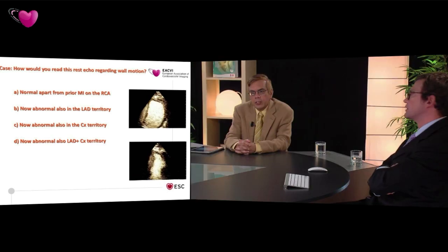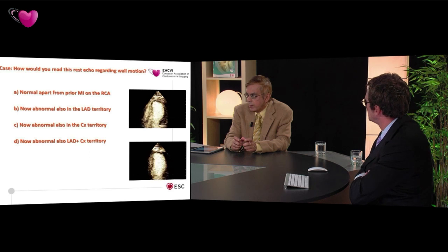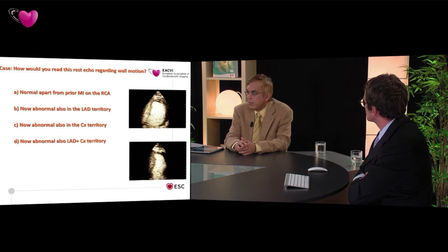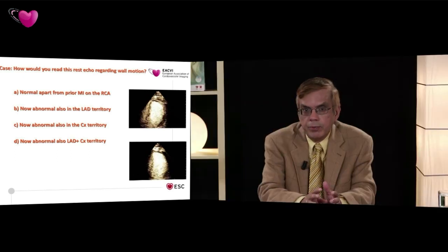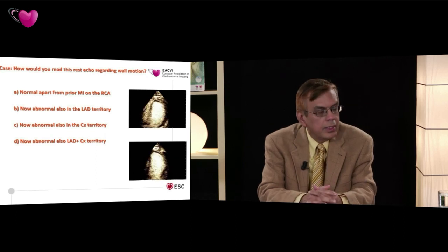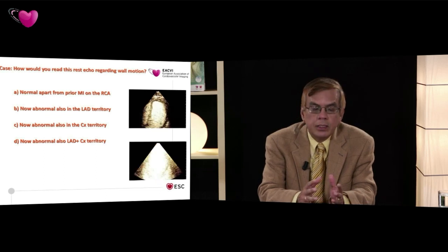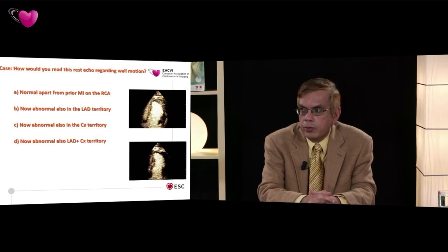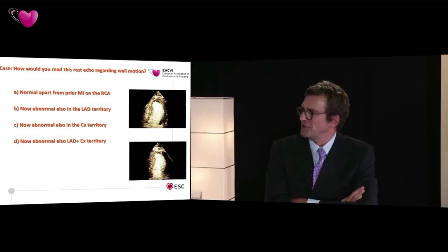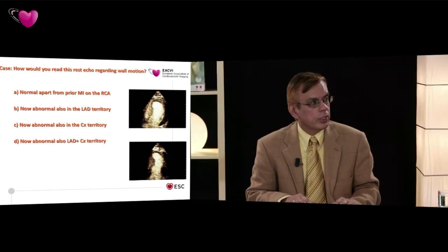That's right. I think regadenoson has the advantage that it's a single bolus dose, 400 microgram, given very quickly over 5 seconds. And you've got 3 to 4 minutes to image, so you've got plenty of time to image. The whole study finishes in 10 minutes, but it is limited by its cost. It's a costly agent, but the nuclear cardiology department uses it a lot. Okay. You can steal it from them. Yes, absolutely. That's what we do, we have a regadenoson protocol in our department.